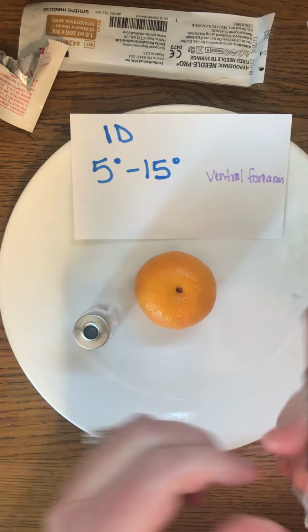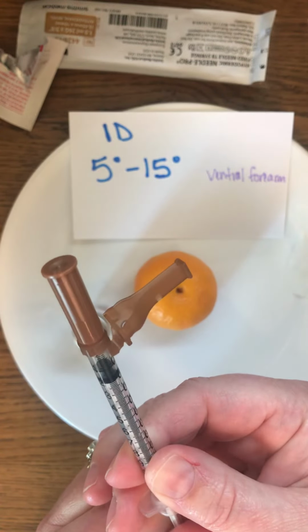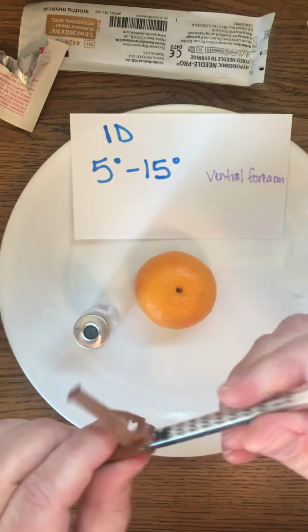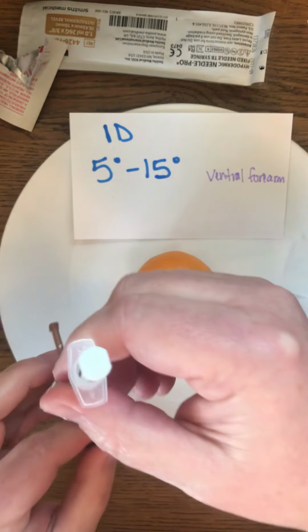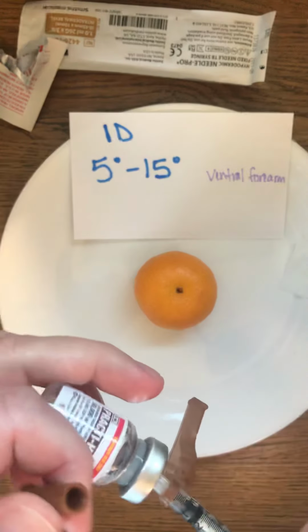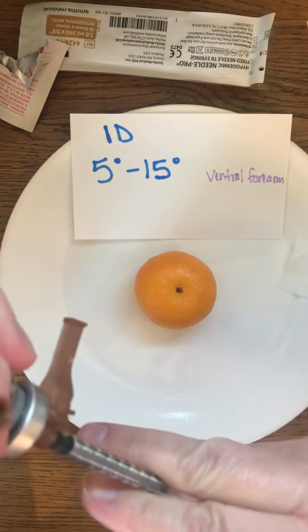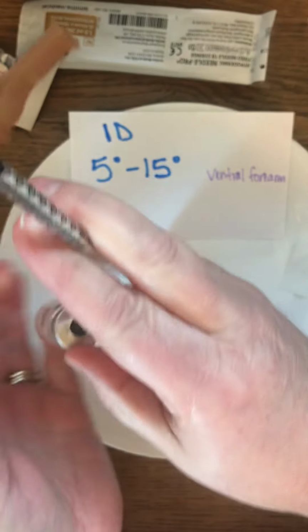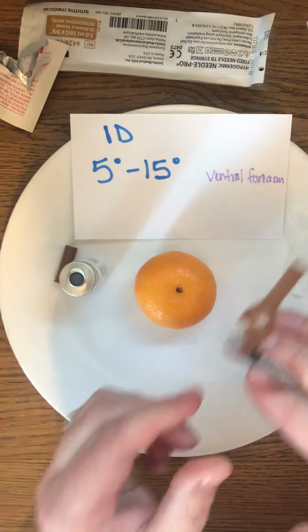We don't draw up very much, so we're only going to draw up 0.1 mils. I'm going to get the air in first. I've already cleaned my top. I'm going to go in like this. I'm going to inject the air in, and then I'm going to pull back. There we go. If we're going to use this right away, we don't even need to recap.